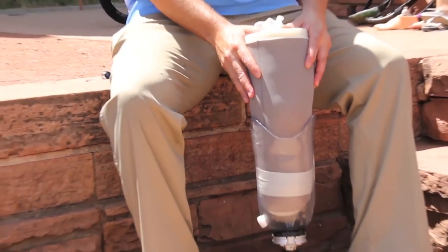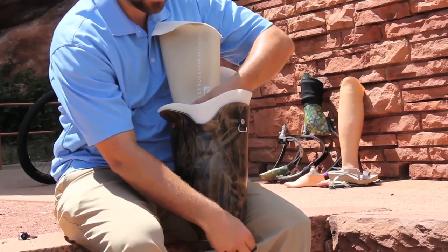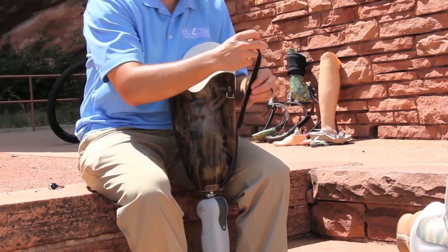Gel liners which are used to suspend the prosthesis will have a pin or strap attached to the bottom, which fastens to the prosthetic socket with a clip or locking mechanism.